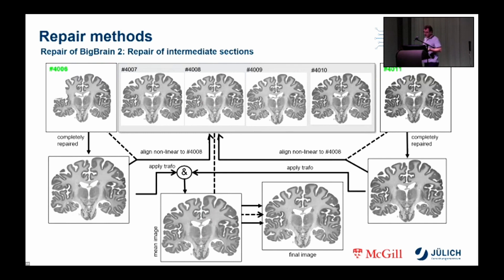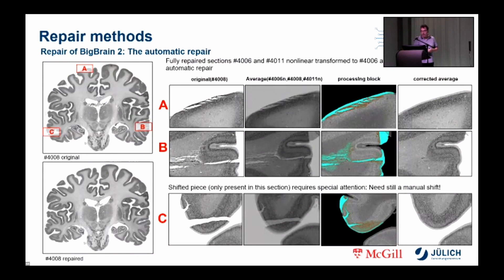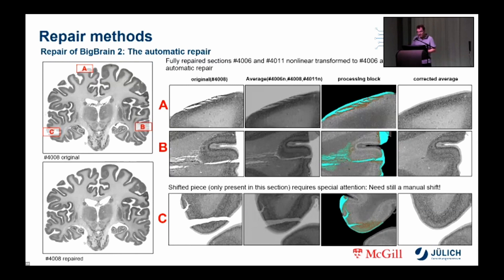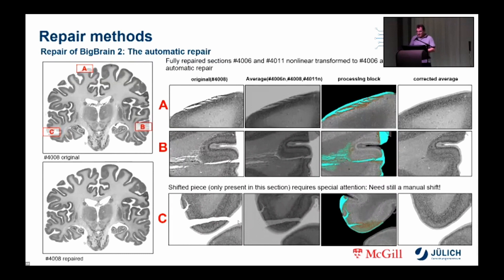Similar to what was implemented for BigBrain 1, for automatic repair the transformed fully repaired sections 4006 and 4011 and section 4008 were averaged. Areas in need of repair turn out to be outliers that deviate significantly from the calculated mean. Identified areas in need of correction are then automatically repaired by replacing the tissue in section 4008 with tissue from the fully repaired non-linearly transformed sections 4006 and 4011. However, for the shifted piece in sample C, an additional manual repair was still necessary. Of course everything works well only if the sections have been transformed very well, and this is also controlled via the quality control tool.